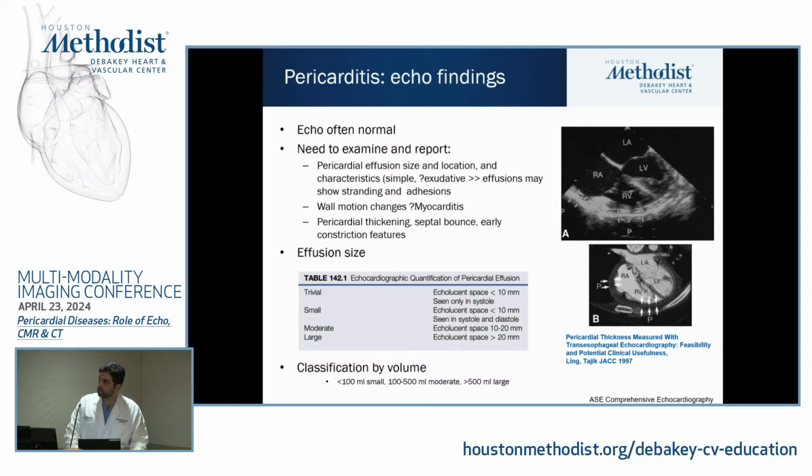where you look at echo and it looks very small or not really that impressive as it does on CT. The pericardial volume itself is still the same, but on CT you're getting a much wider field of view. There are scenarios where if the CT was not gated and done during systole, the heart will be contracted, and then the effusion may appear to be larger than it does when we do the echocardiogram. The physiologic significance of the effusion is still primarily assessed by echo and your clinical assessment.